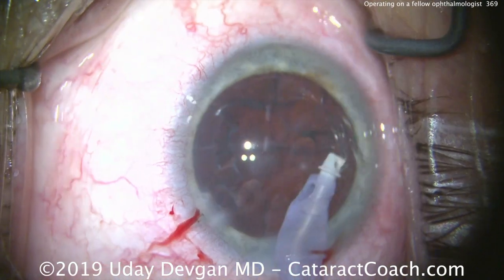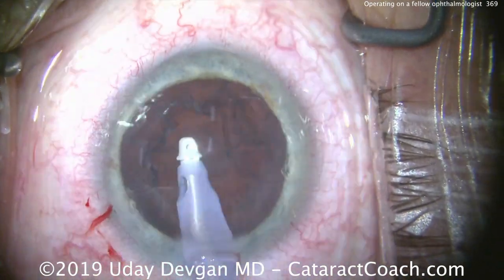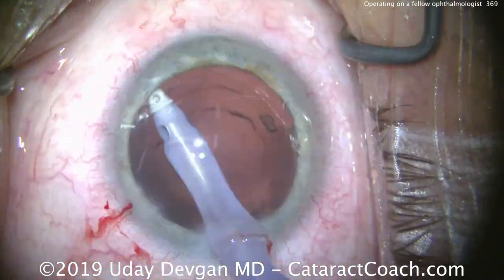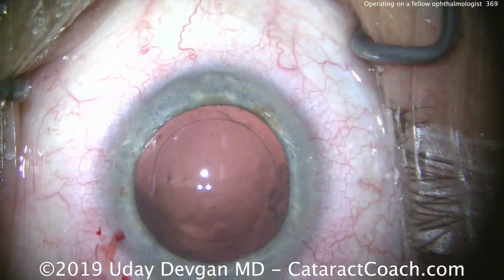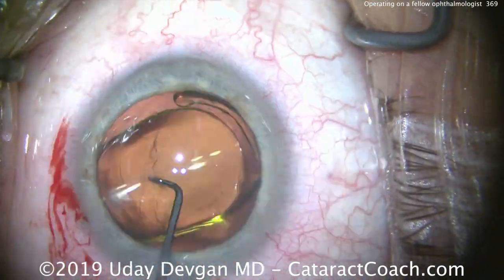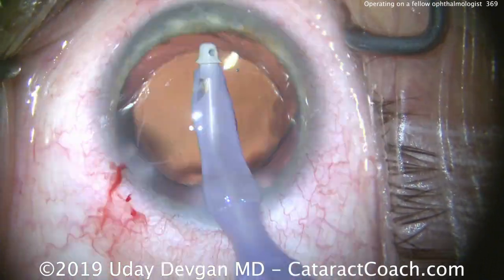So cortex removal, let's speed this up a little faster. The rest of the case is pretty normal. And at the end here, monofocal lens, going in the bag, polish the capsule, not going overboard.